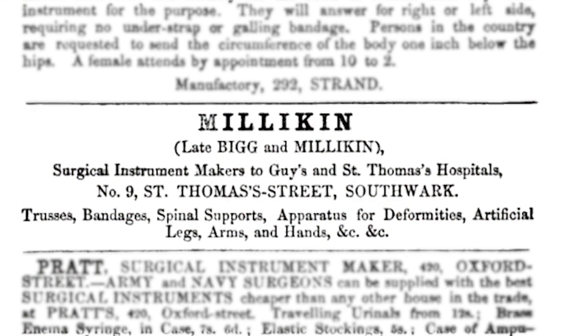His father, John Millican Sr., had supplied similar equipment to medical practitioners and students at St. Thomas's Hospital from his workshop at the site of this museum.